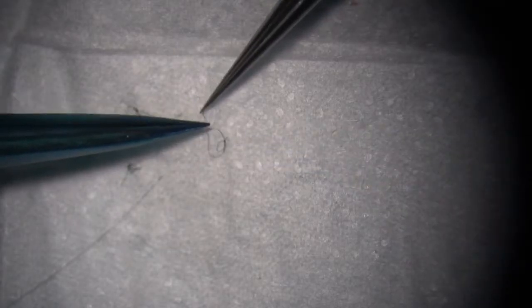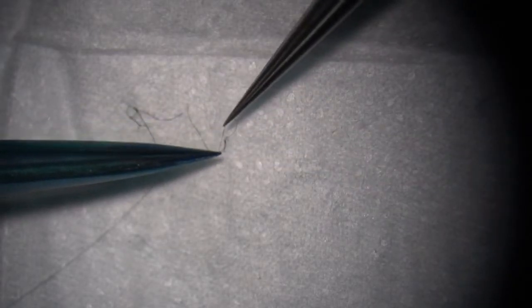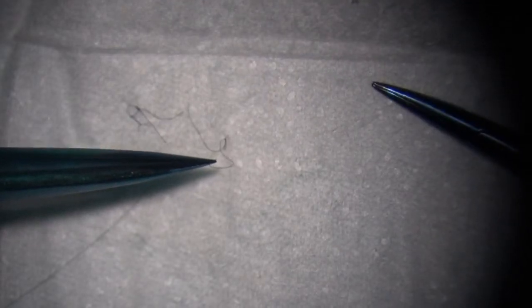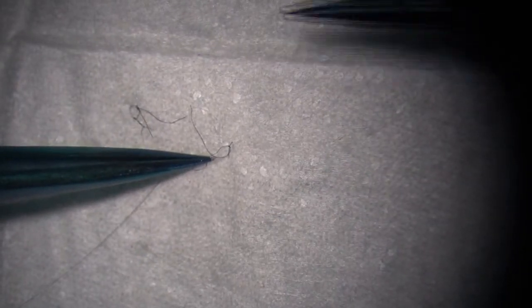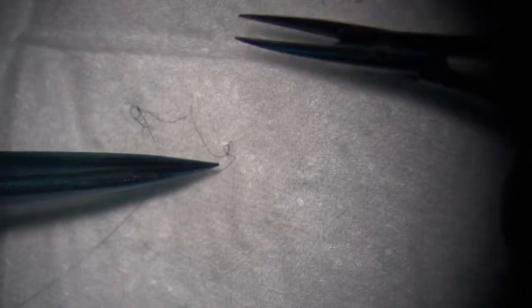Do you recommend changing how you hold the needle driver? Because for me, I'm hitting my hand here. If I hold it like that, is that appropriate? Nope. Yeah, just keep it here. Close to the tip. The closer to the tip, the better control you have.